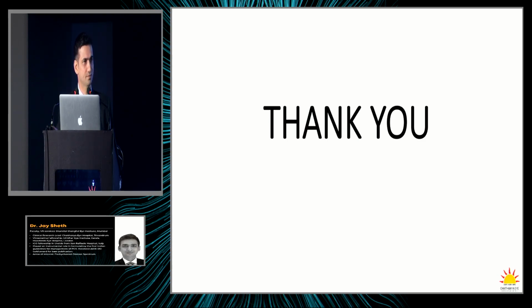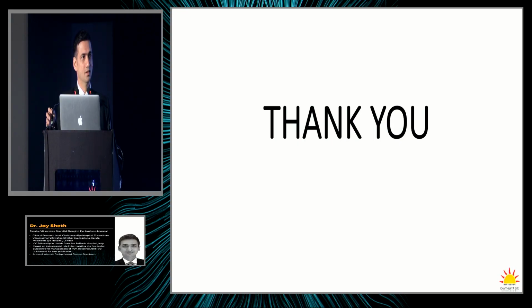Can I add a comment? As far as segmentation, one of the advances in these softwares is that it has reduced to a great extent the requirement for manual segmentation. If you start doing manual segmentation, it's time for you to almost retire because you'll never be able to finish one image. But one thing you could do is try to do whatever you can when the patient is with you in front of the machine. Retrospectively, it could become very difficult because you cannot correct everything and you might have to take a new scan.